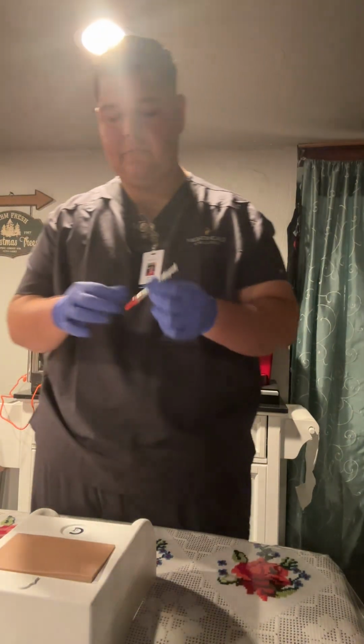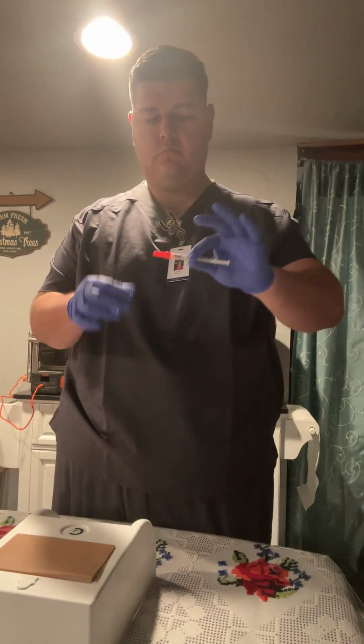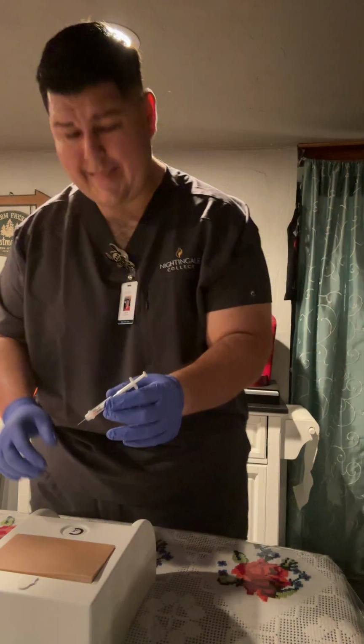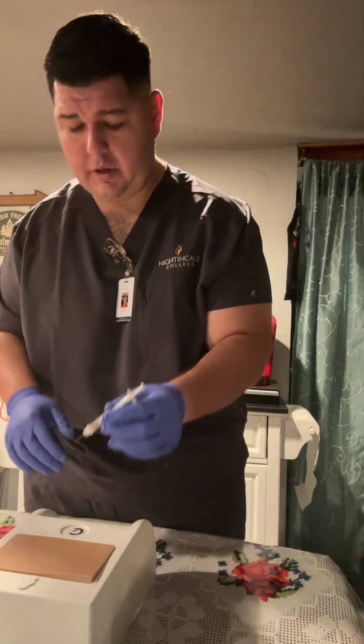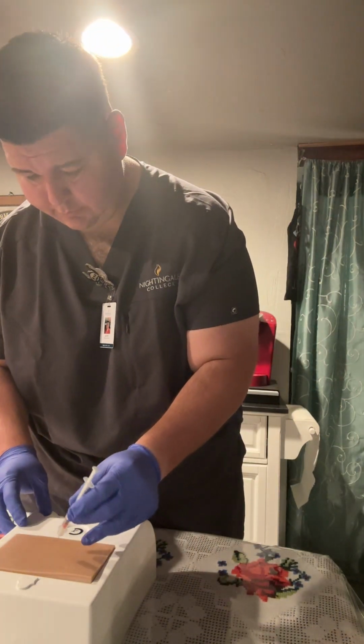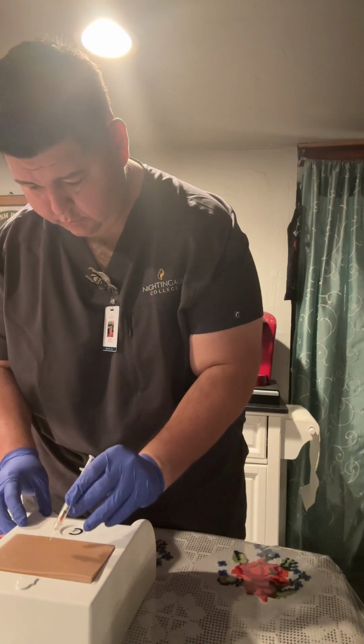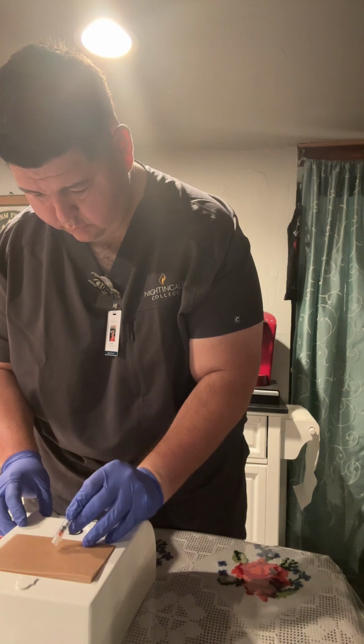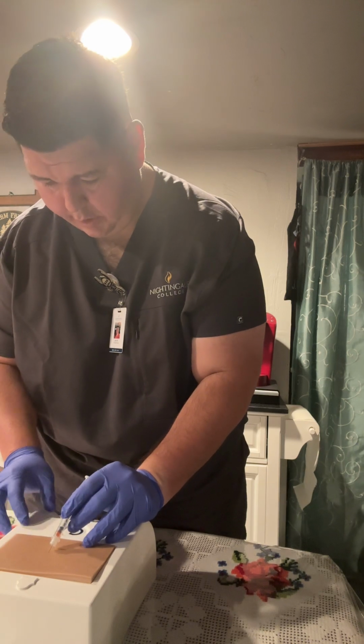All right, so here we go. Removing my cap. I have my syringe. Want to hold it down. And at a 5 to 15 degree angle, I go ahead and inject. Okay, I'm there. So at this point, I advance the needle through the epidermis about 1/8 of an inch and slowly inject the medication.